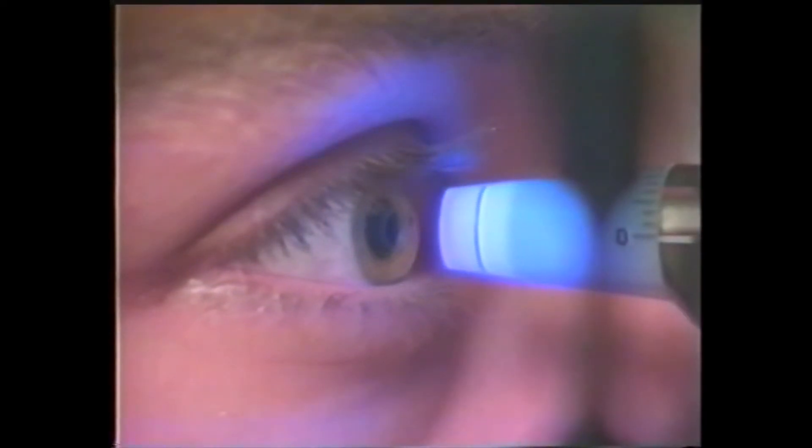If the patient is not intimidated by the advancing tonometer tip, you can eliminate holding their upper eyelid. Adjust the tonometer prism and cornea contact with the joystick so that the mires are symmetric.